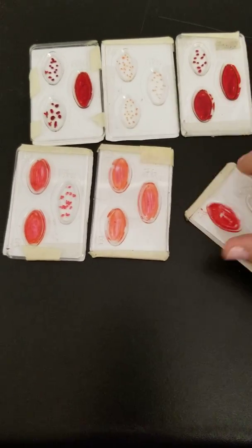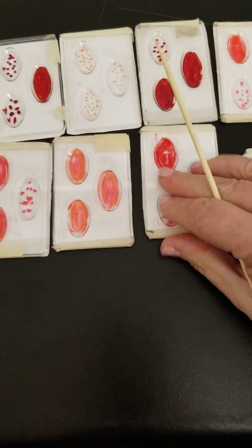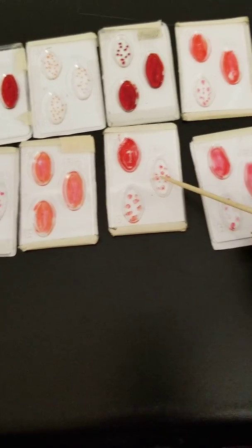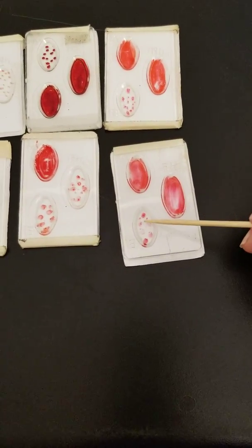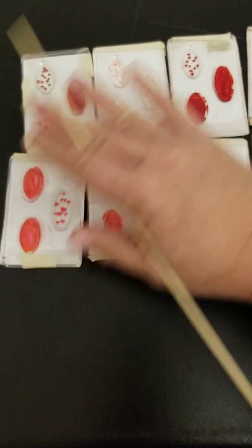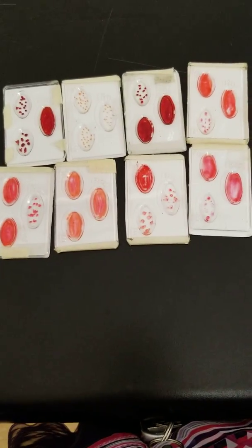This one's also flipped upside down. There we go, flip it around. This one would be B positive, and this last one would be B negative. So that's how we would read these plates. And there'll be some examples of them on the test.